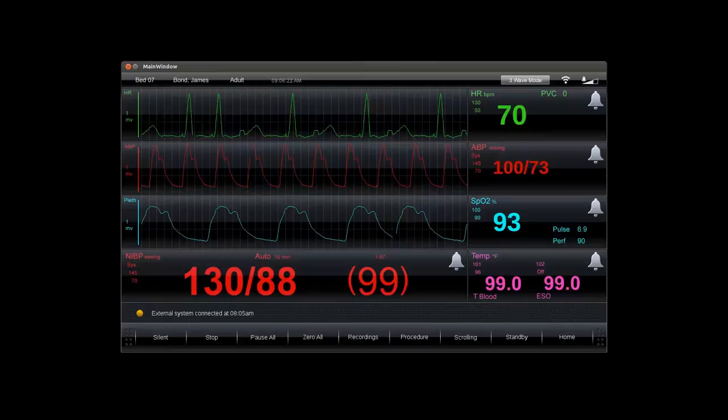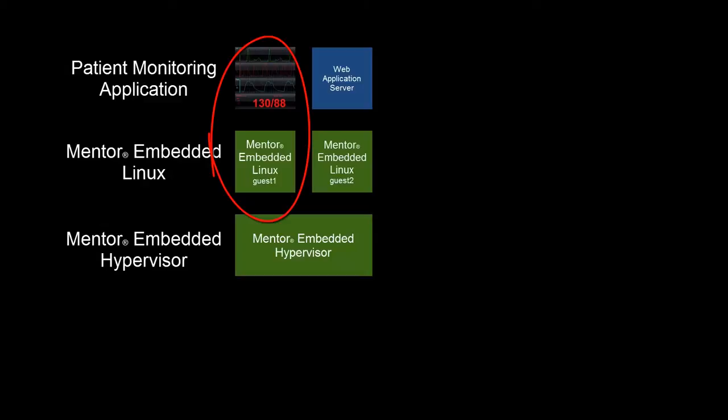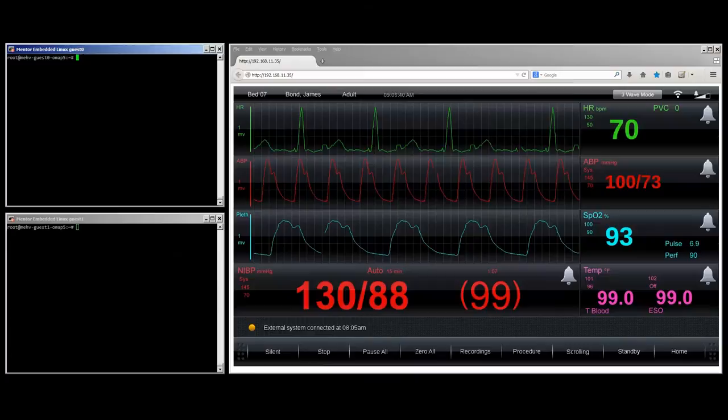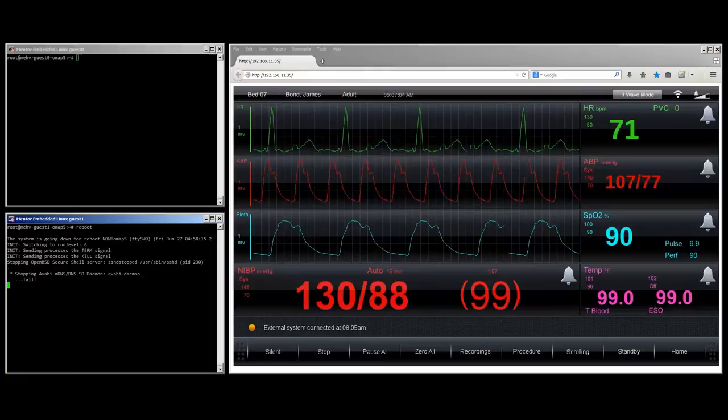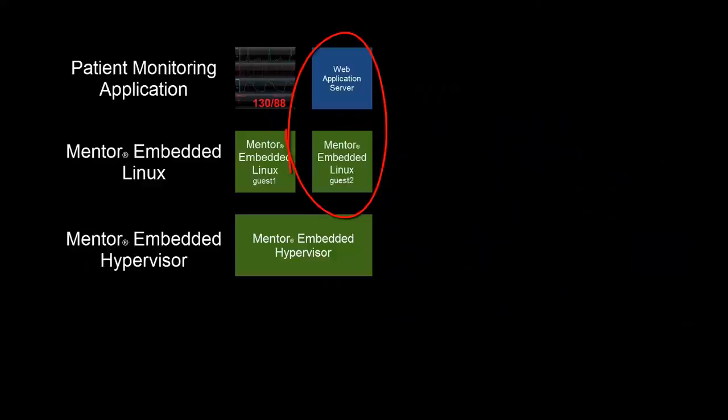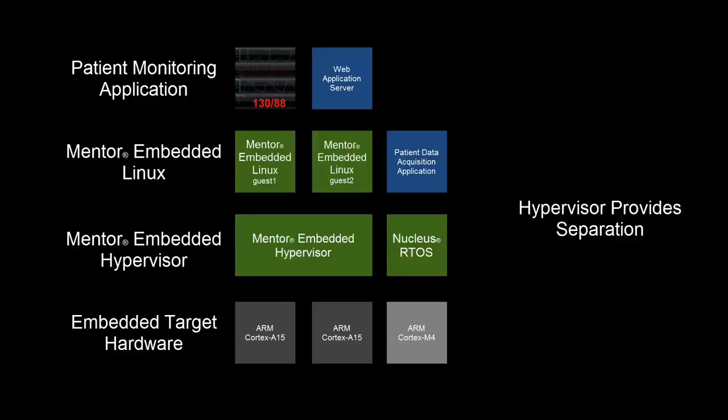Our Qt-based patient monitoring application runs on the first mentor embedded Linux guest in a two-guest supervised environment. Here we see consoles for guest 1 and guest 2 besides a browser. This browser is receiving a stream of images published by a web application running on the second mentor embedded Linux guest. Rebooting the second guest will cause the browser to fail to load image data.